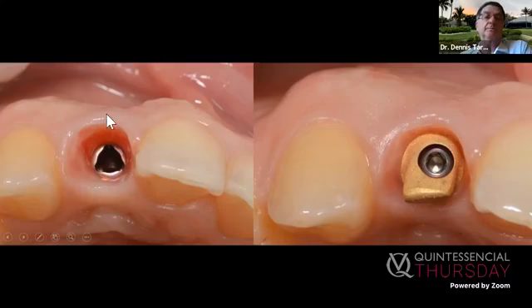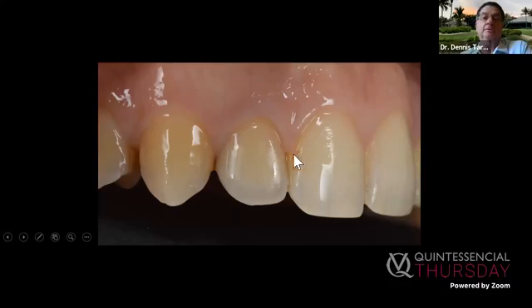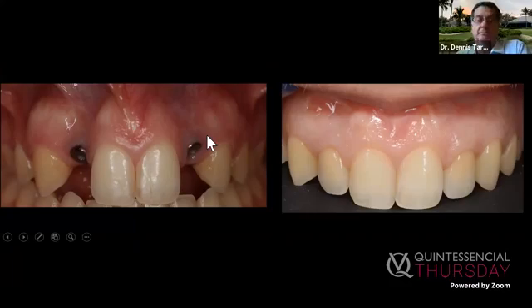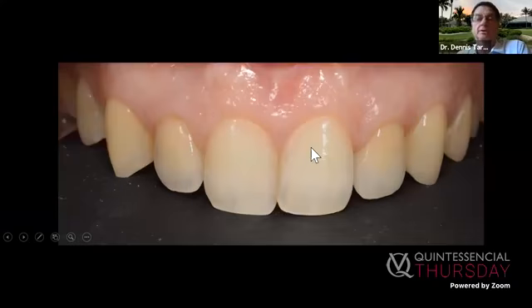Here you see the angle of the implant that was put in incorrectly. It's pushed out well enough. Here you see the right side. She had both sides. I think we got pretty good response. The papilla are intact. Notice you don't see any major grooves because the attached gingiva was intact. And here's the before that I showed you. And there's the after, both laterals. I think we got a decent result. I'm very happy with the thickness of the tissue, the profile, the position of the height, everything about it. We've got it to come down. So there's the final case in place. And I think we're in pretty good shape.